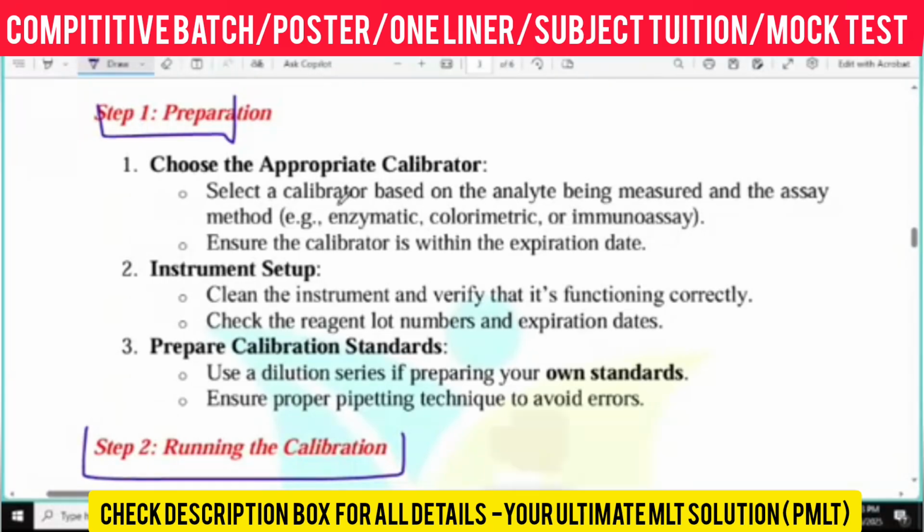See, now we are coming to the preparation section. How do we prepare the calibration? Use the appropriate calibrator. I have already told you that it depends upon the reaction, which might be enzymatic, colorimetric, or immunoassay. You have to choose the calibrator before its expiration date. If the date is expired, it will not work. So you have to choose the calibrator properly within the expiration date.